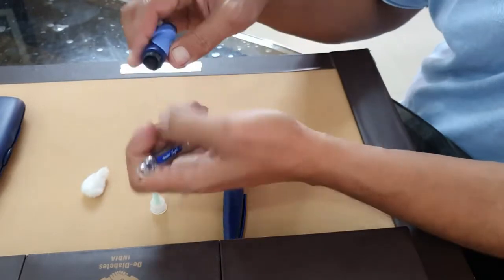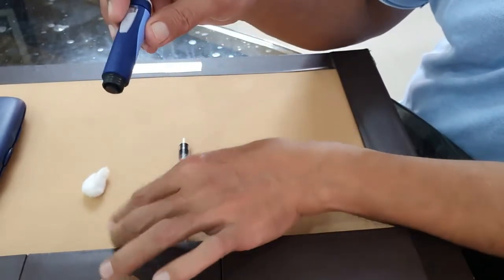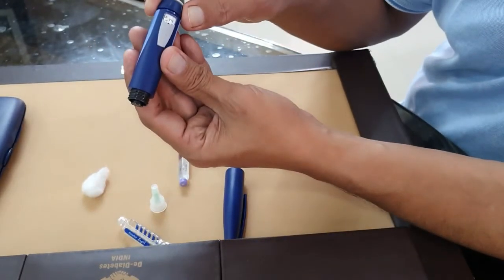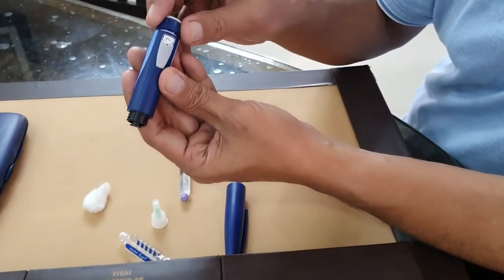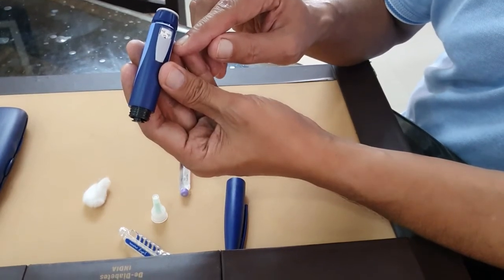The base of the insulin body has a piston in the bottom where you can slowly rotate like this. That is the measure by which you are going to inject the insulin.